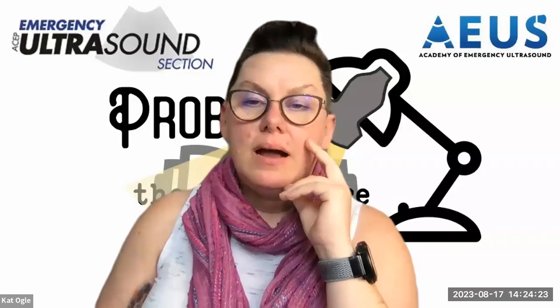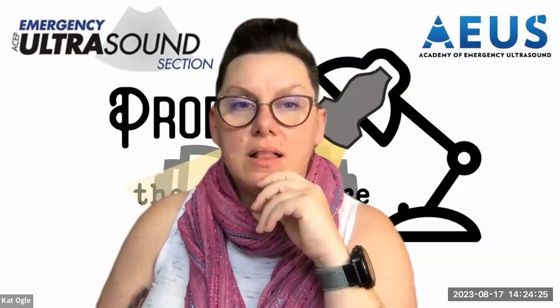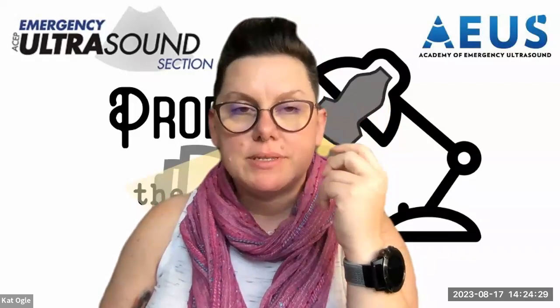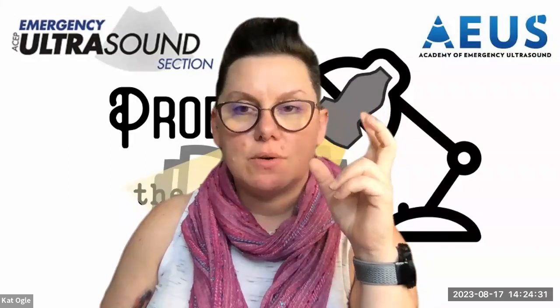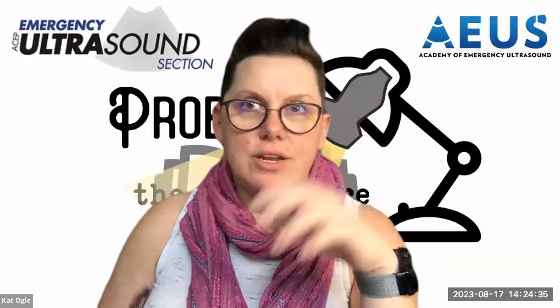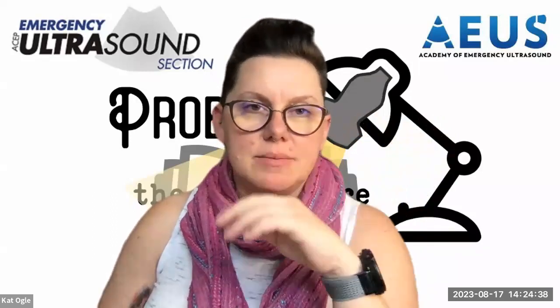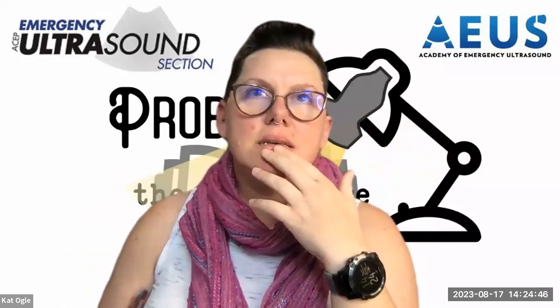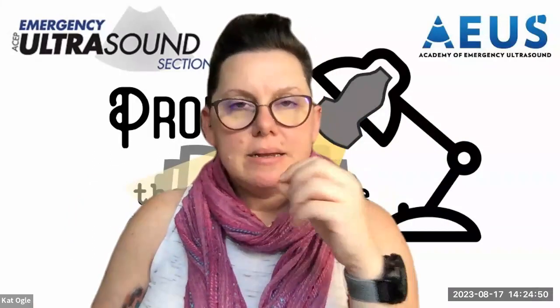Got it. So Jeff, not all of our trauma activations are hemodynamically stable. We have 2 levels of traumas at GW. One is a trauma white, which is a lower acuity trauma, and it's really loss of consciousness mechanism. Your higher level traumas, our trauma yellows, are the ones that would be considered potentially hemodynamically unstable. But we didn't explicitly parse out that data.